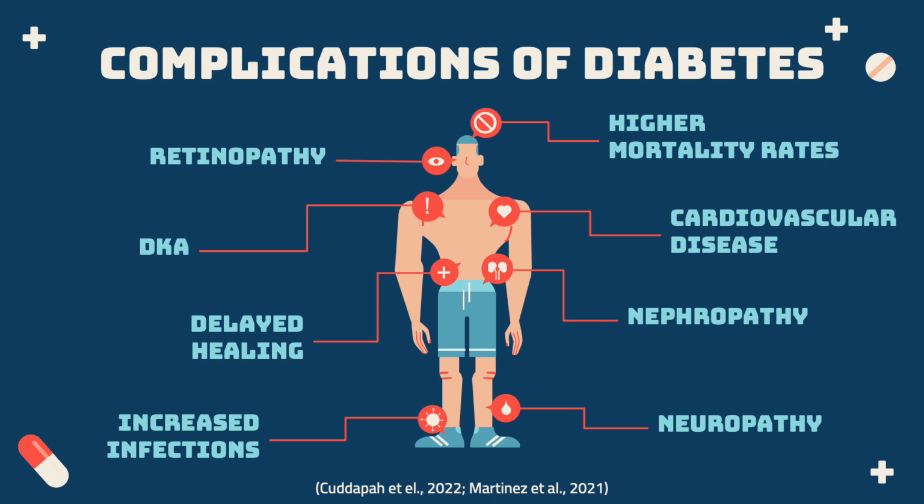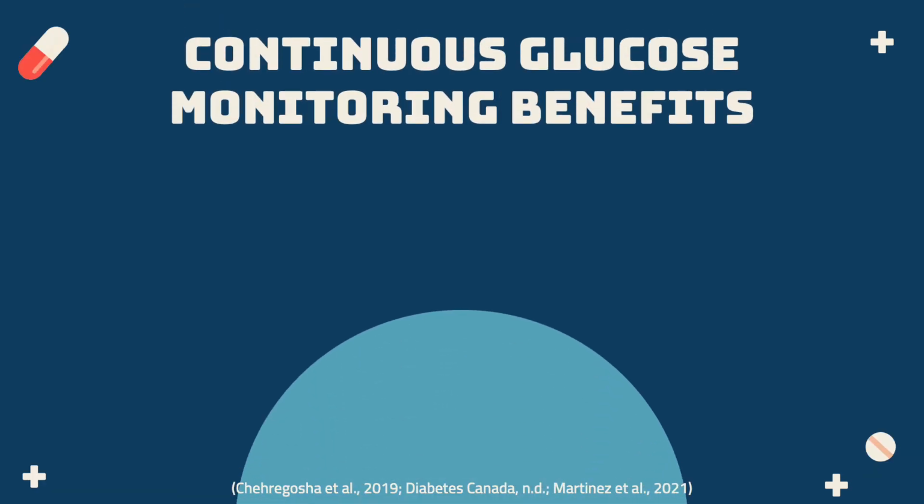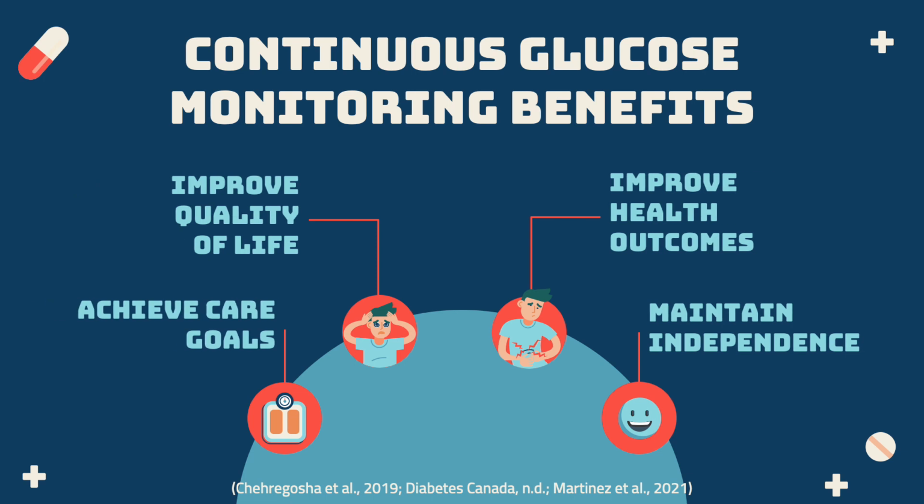While continuous glucose monitoring does not in itself control glucose levels, the technology can mitigate the negative impact of many risk factors for long-term complications by improving self-management in a cost-effective manner. In addition to reducing long-term complications of glycemic variability, continuous glucose monitoring can help patients achieve short-term treatment goals, decrease anxiety related to highs and lows, and improve quality of life.